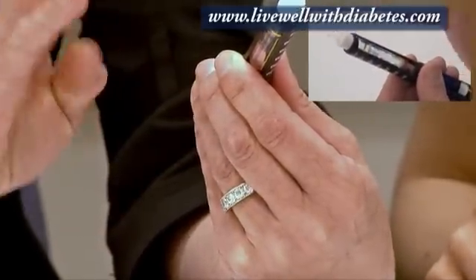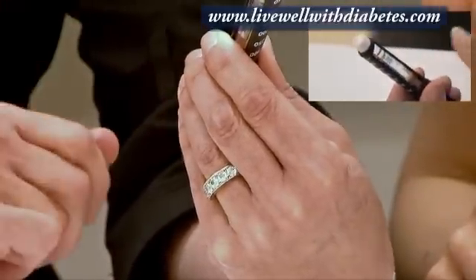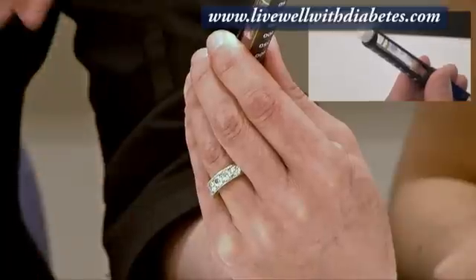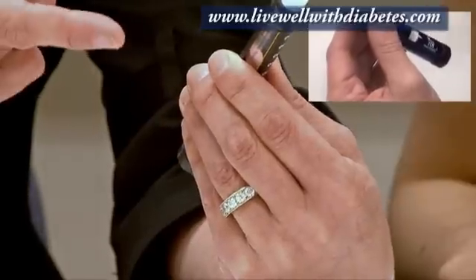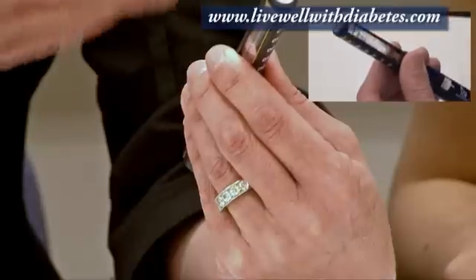When you first put a brand new tube in, you turn it to number four and push the button to see insulin come out. After every injection following that first time, you just turn it to number one. The reason for the safety check is to make sure there's no air in the system and that you can see insulin come out.